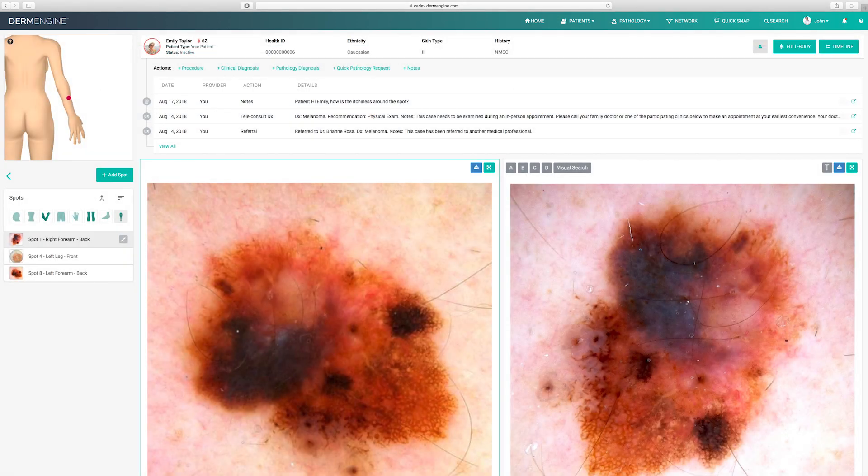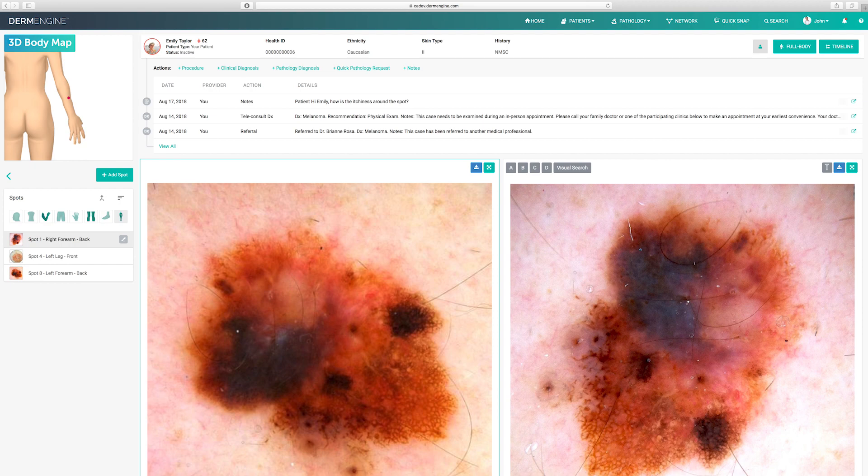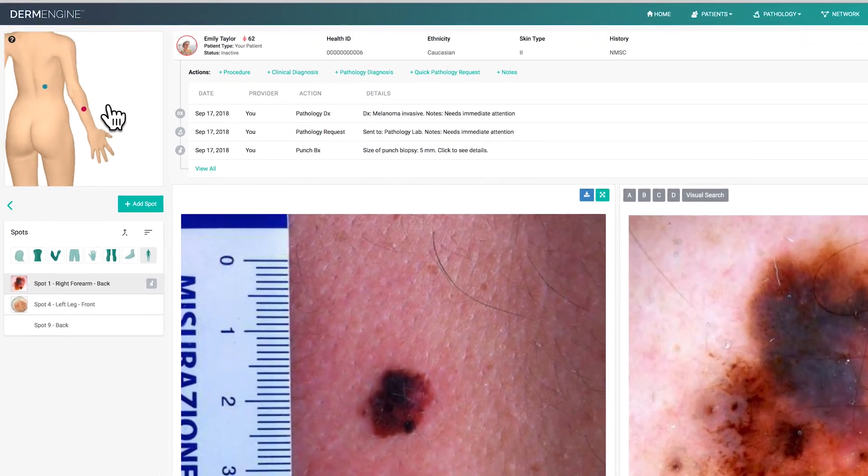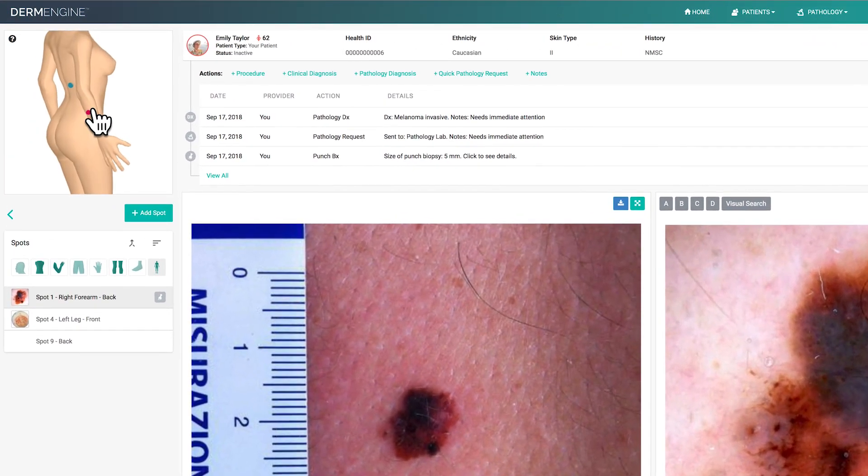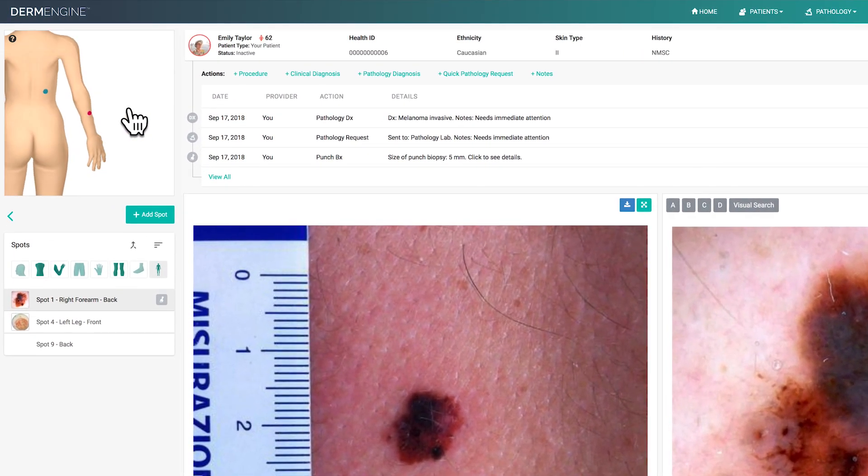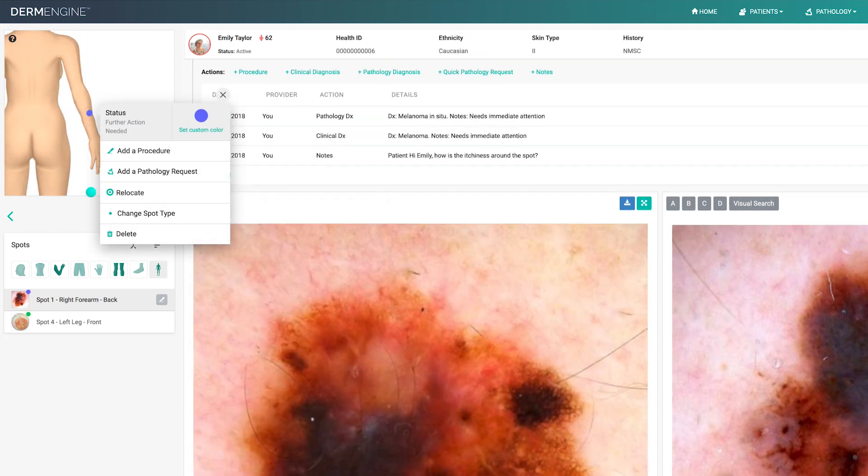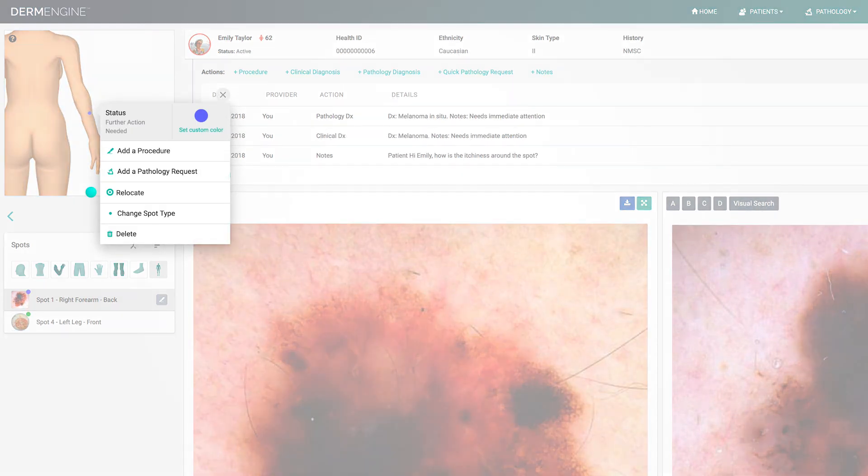On the left side, you'll notice a 3D body map showing all of the patient's spots. Like the phone app, you are able to click and drag the body map to view all the spots with ease. Right clicking a spot lets you relocate it, add a procedure, a quick pathology request, change that spot type, or color code that spot.